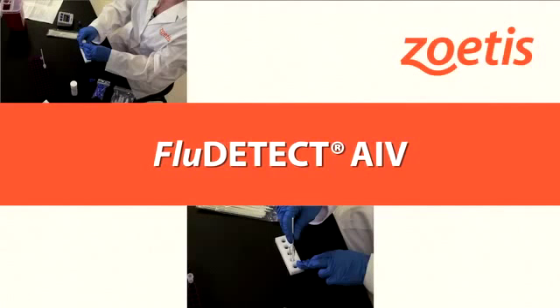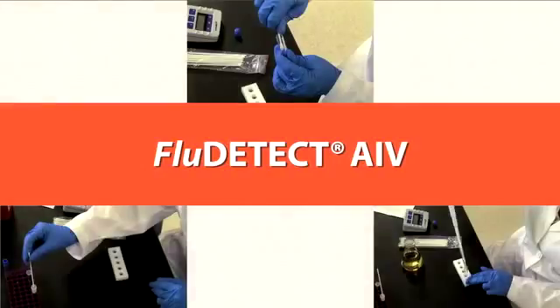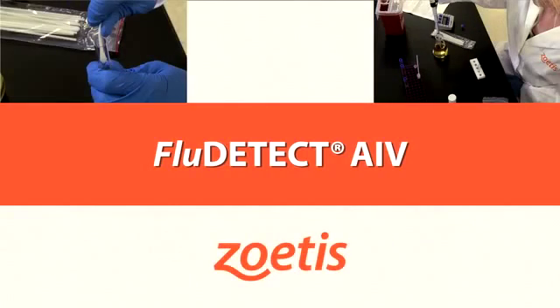FluDETECT Avian Influenza Virus Type A Antigen Test is an in vitro rapid immunomigration (RIM) test designed to aid in the qualitative detection of avian influenza virus type A in tracheal, oropharyngeal, or cloacal samples from symptomatic birds or flocks. This assay detects all 16 subtypes of influenza type A virus. Positive results should be submitted to a reference lab for confirmation and subtype determination.